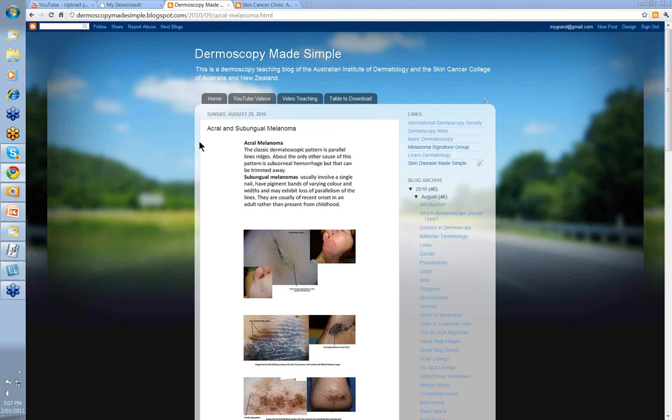An acral melanoma usually occurs on the palms of the hands or the soles of the feet, and the classic dermatoscopic pattern is parallel lines on ridges. About the only other cause of this pattern is a sub-corneal hemorrhage, but you can take a 15 blade and quietly just trim that away if that's the case. So, parallel lines or ridges for an acral melanoma.